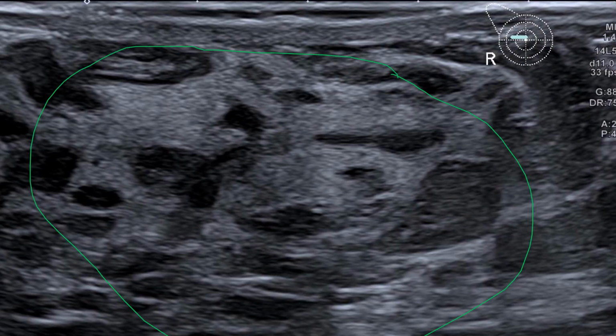This configuration is what is called fibrocystic breast morphology, or diffuse cystic mastopathy. That's the morphology that we have there. It's mostly a variant of the normal breast, and this type of breast can also present with pain with a morphology or configuration like this. So it's called fibrocystic breast or diffuse cystic mastopathy.